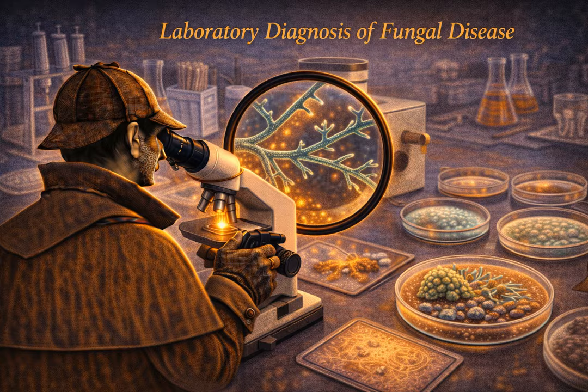A dry swab is useless. If you send a dry swab with barely anything on it to the mycology lab, they're going to report no growth. Not because the fungus wasn't there, but because you didn't give them enough of it to recover. You need a chunk of tissue. You need a full vial of fluid. You need deep scrapings. You need volume.